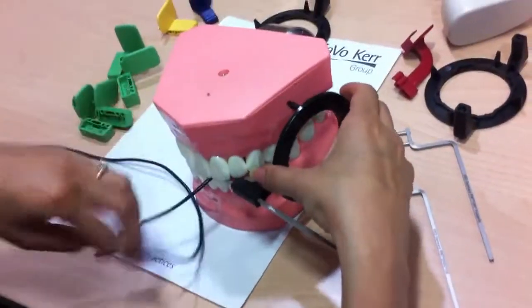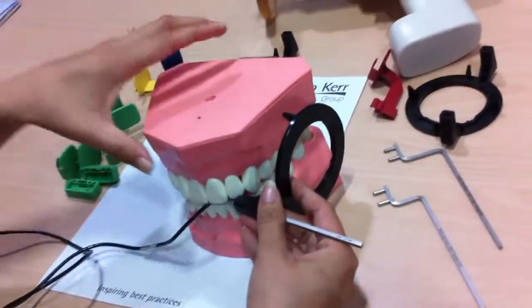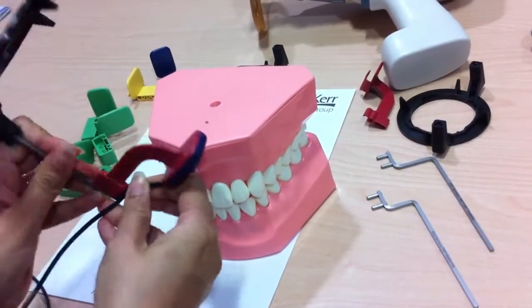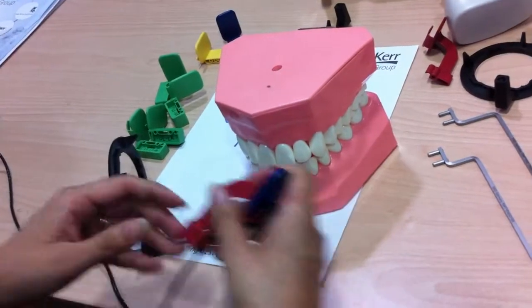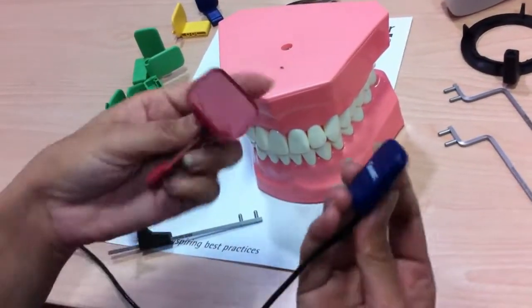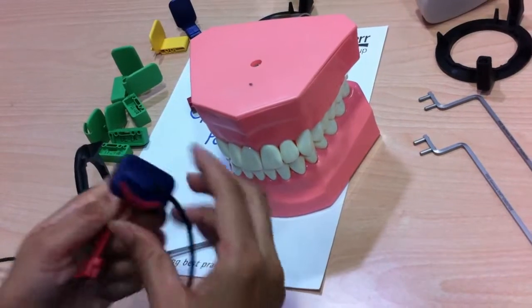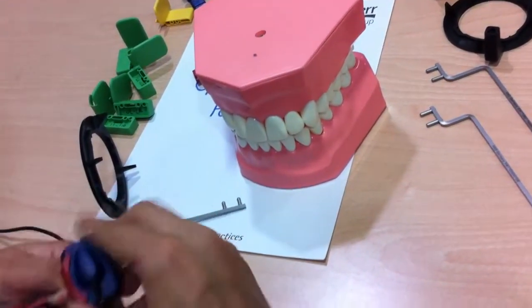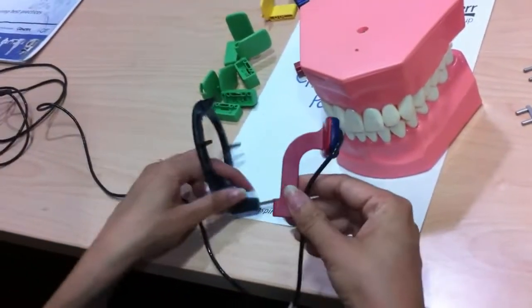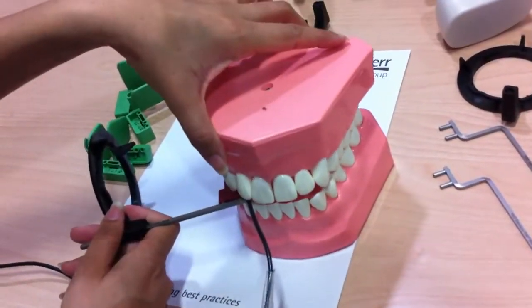The X-ray tube will aim at the ring, so we will not illustrate the use of the X-ray every time in this video. Next is the positioning for the horizontal bite-wing. Again, the same rule applies: the active area of the sensor should face the flat plate on the holder, with the wire positioned accordingly.